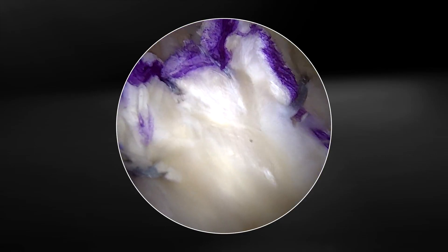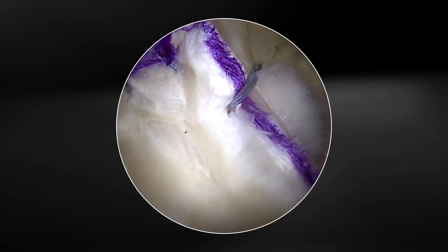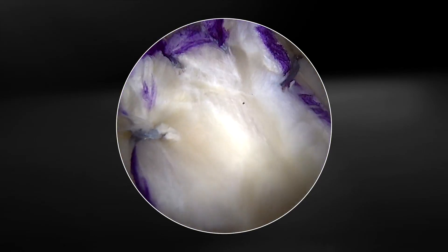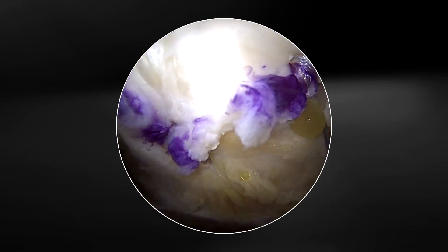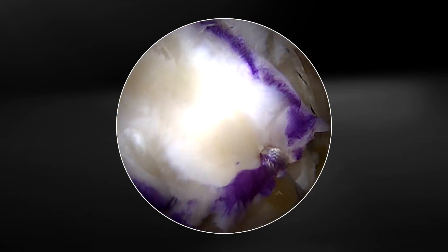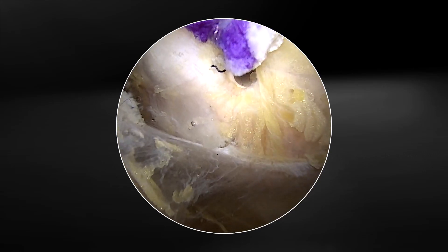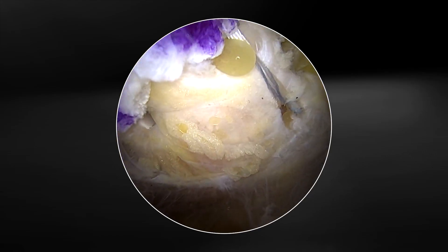It has my favorite configuration of two stitches medially that are simple to spread the patch out — one suture anteromedial and one suture posteromedial — which does a beautiful job of spreading the graft out. We've got the critical portion of the rotator cuff repair covered. This is where the tenocytes need to be, and we've got our posterior lateral push lock in place and our anterior lateral push lock in place as well, and this completes the construct and the repair.